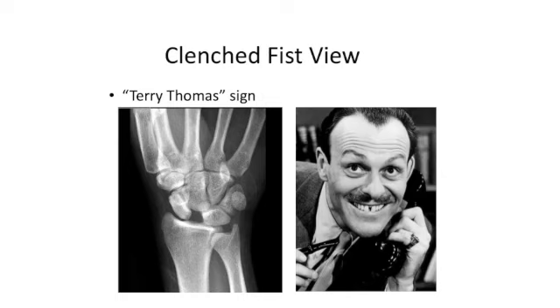So the clenched fist view is most commonly known by the eponym the Terry-Thomas sign. Terry-Thomas was a comedian in the 50s and 60s. I've heard he's very funny.